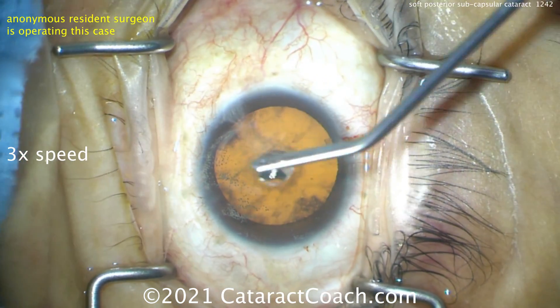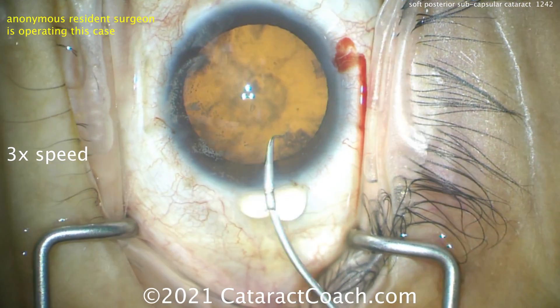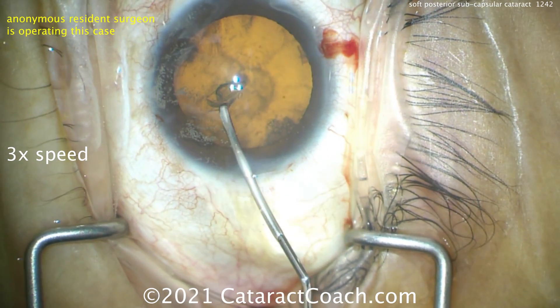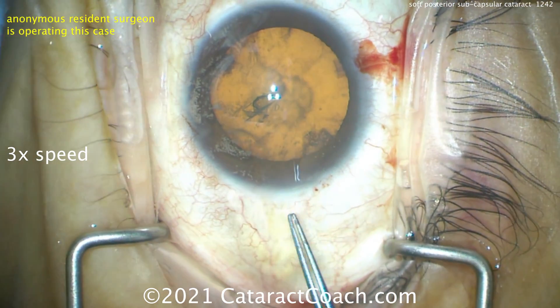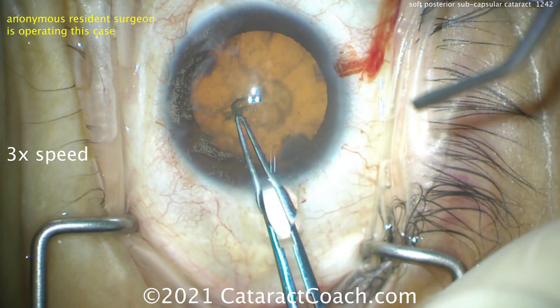Now here comes the rhexis — going to aim for a nice five millimeter capsular rhexis, centering up that eye. This is the tome. I don't use this tome to do capsular rhexis in general, but the residents like to — hey, whatever floats your boat, whatever makes you happy, go for it. So here comes the rhexis.